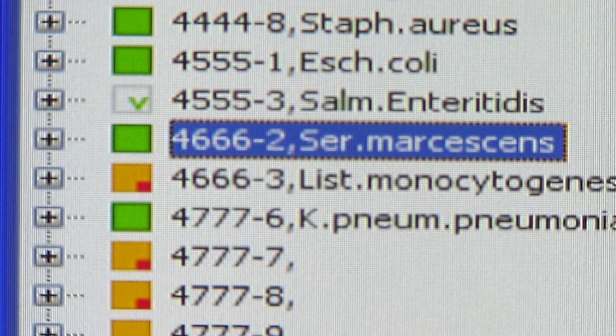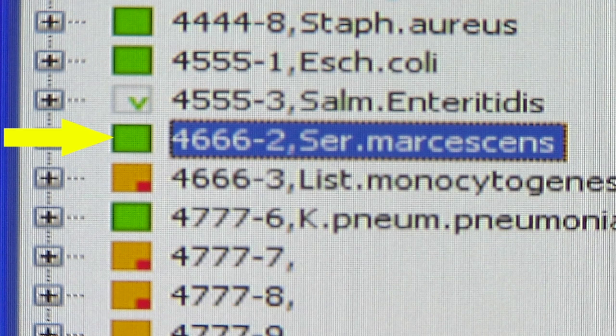Once all missing information is added, the isolate status will change to Final, Complete, or To Be Reviewed.